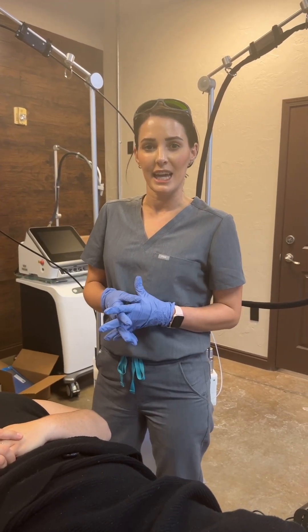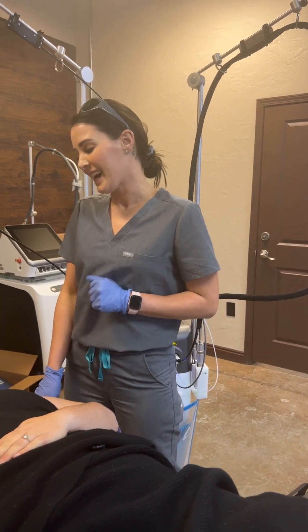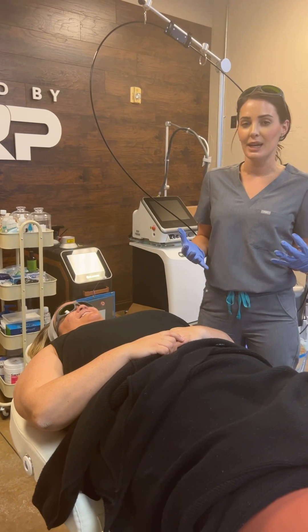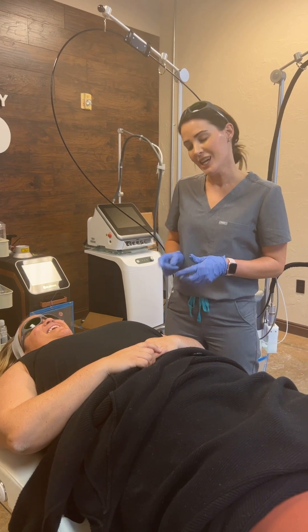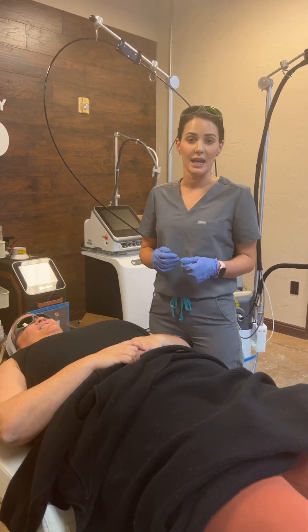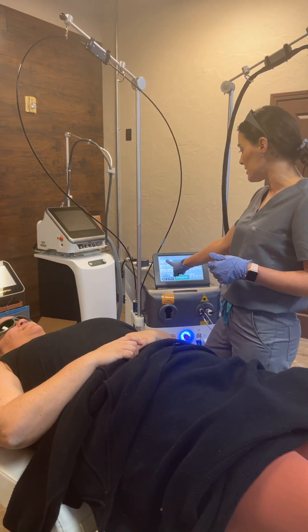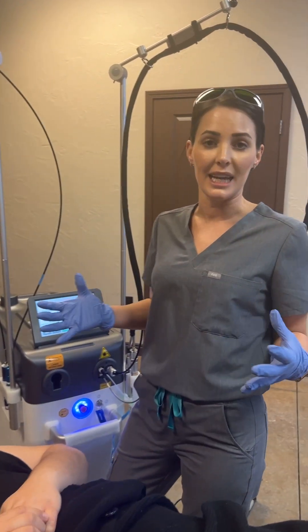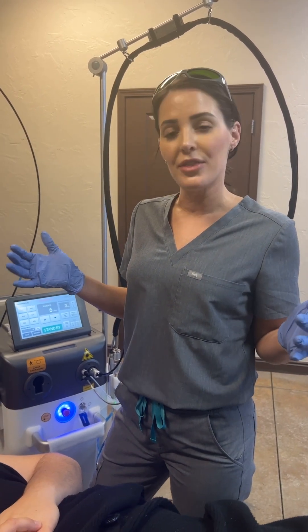Our patient getting hair removal for the first time is Cassandra. She's very excited — she's been doing waxing, but I can't wait for her to see what hair removal does and how it can change her life. We're going to be doing her underarms. She is a skin type two, so we're going to use a 755. I touched the preset on mode one and it went to the settings I wanted to treat with. We're going to do a test spot — no gel needed — and then go from there.